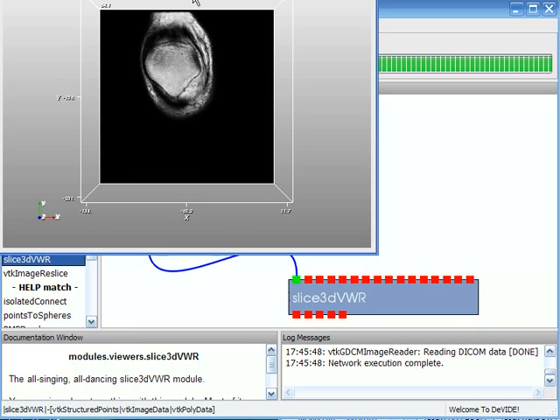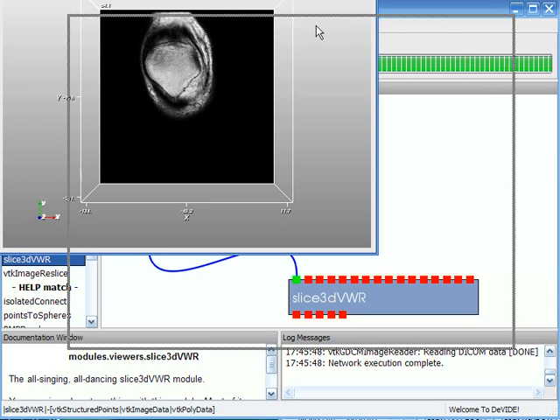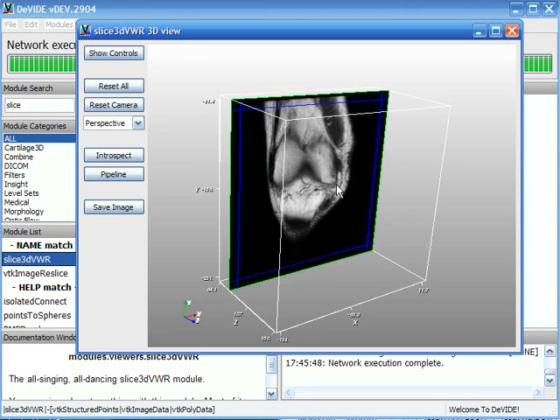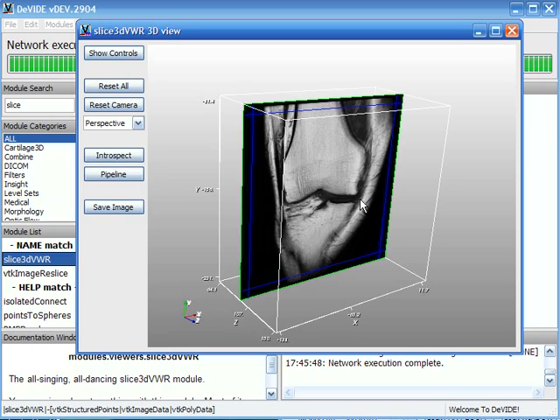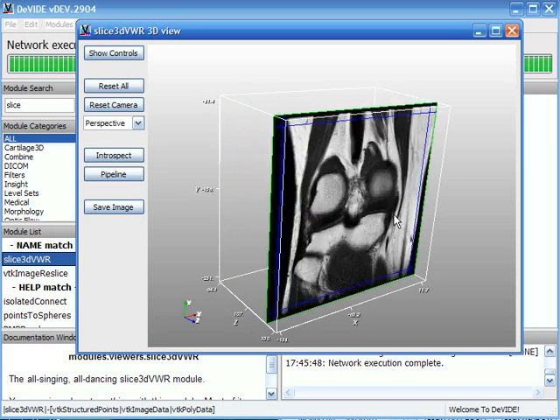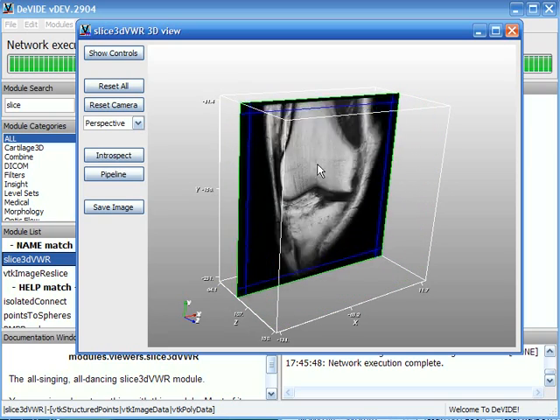There we go. And now we've loaded in that whole series as a volume and we can continue processing with any of the other DeVIDE modules.